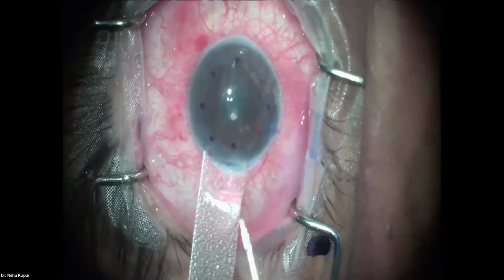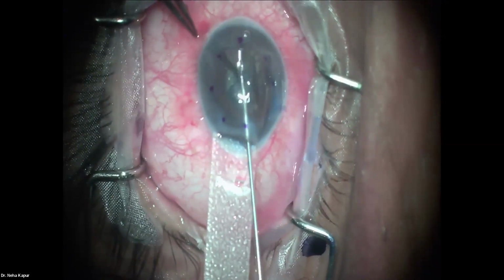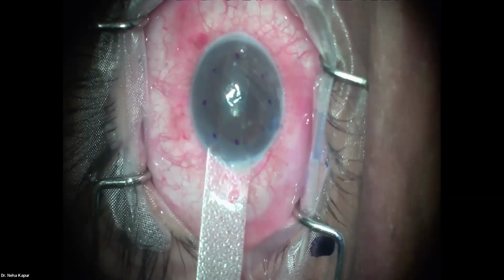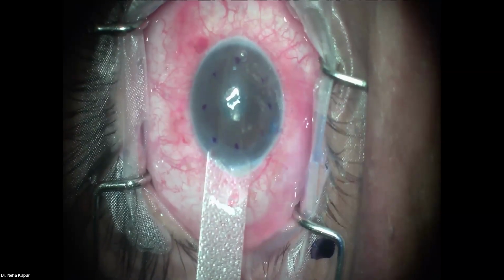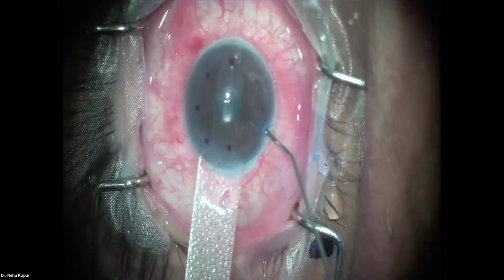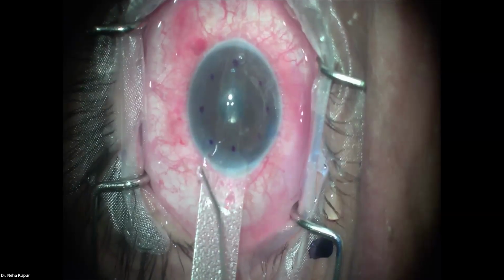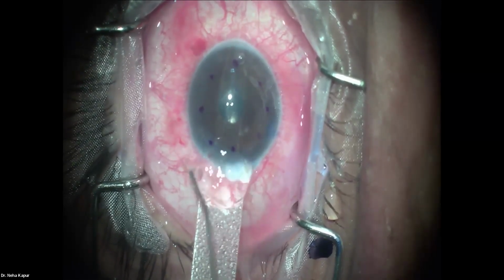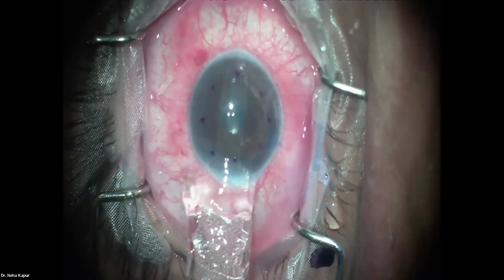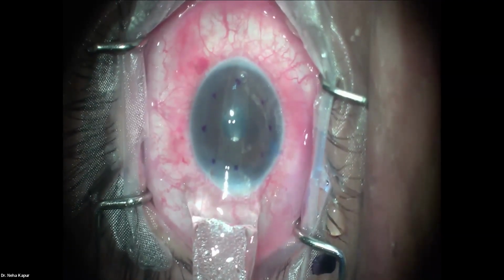Limbs. Going across. Hold and peel. Hydro. Okay. The next step is that we have a cohesive viscoelastic that is placed, and put this in abundance on the sheet's glide because you don't want your endothelium to directly rest on the plastic. So have abundant cohesive placed here, dialer.